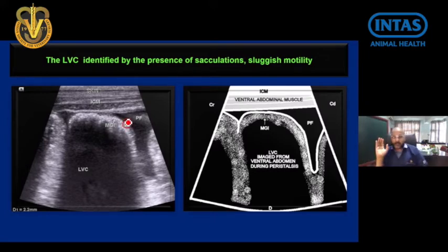And always remember, as in the previous webinar also, they told you that whenever there is an inflammation of the wall, it is marked by submucosal edema. That's why there is a thickening of the wall. So thickening of the wall increases, and you will find an extra anechoic line within the wall, referring to a condition that indicates inflammation. Okay.